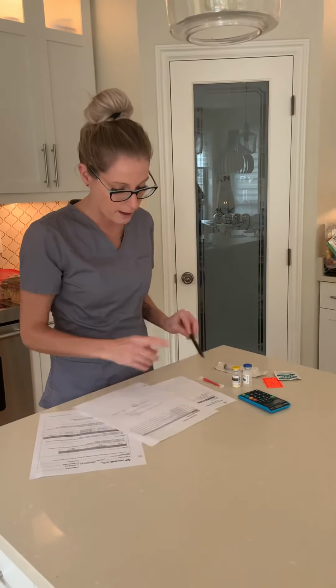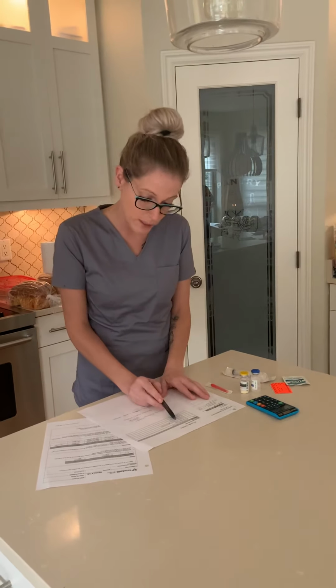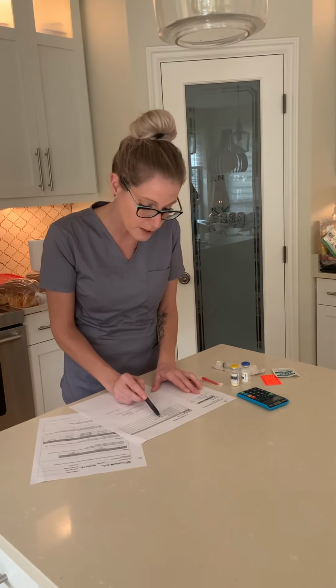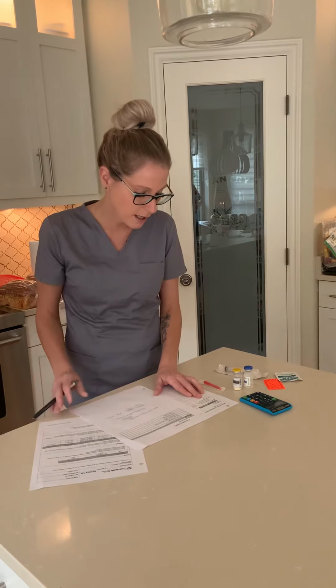So my name is Lindsay, and for this proficiency video, I will be teaching you guys how to draw up IV syringe medications and administer it to my patient. So the first thing I have done this morning is I have checked my physician's orders against the MAR, and it says that I will be giving cefotaxime 235 milligrams IV Q8 hours for 10 days. Okay, so that looks good.